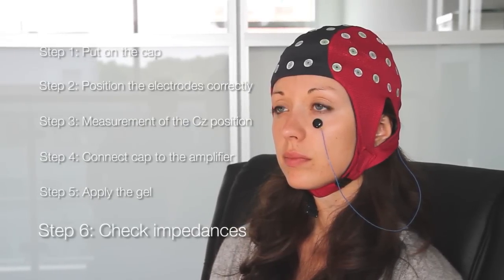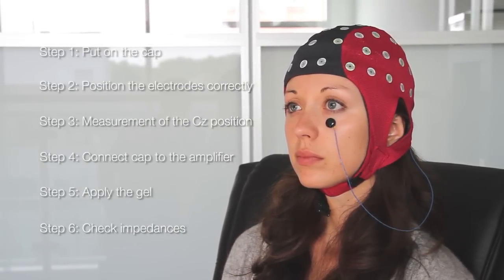As a simple test of quality, you can ask the patient to open and close their eyes and to move their hand.